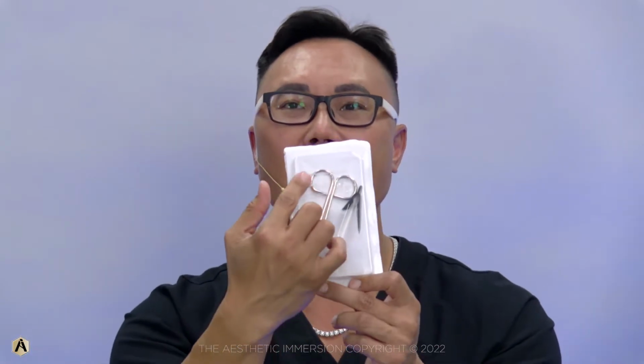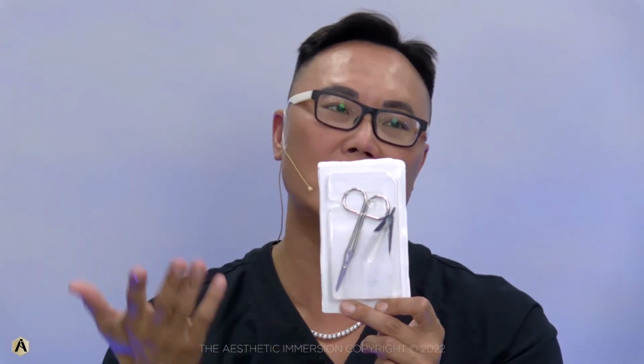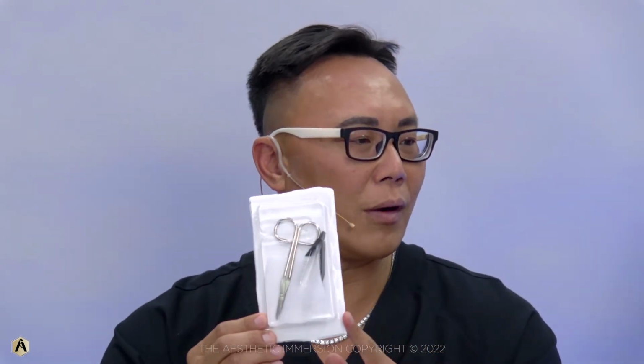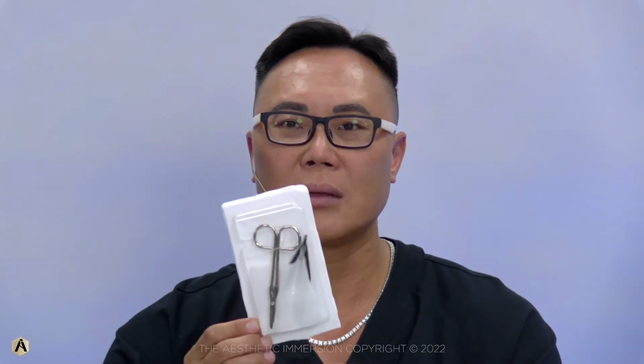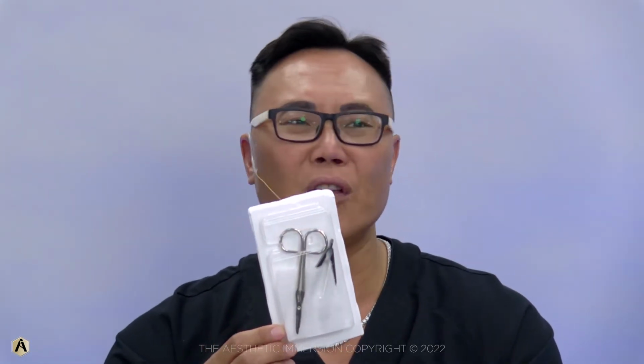I mean, definitely threads. I can't live without these, which is your little packs. I have that forceps too. Ultimately, our little suture removal kits. So many threads. I know you want a sterile package. You can get ones that actually have a tweezer in there as well. It just gets more expensive. The better ones run up to about $4.50, $5 a package. These can go down as low as $1.50. So I mean, these are great.